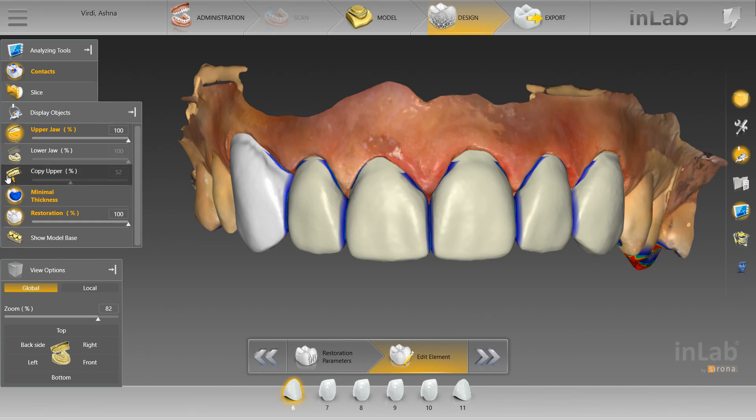So I'm going to overlay the copy scan, and after going through all the steps prior to getting to the design phase, you're going to mark around the wax up to determine what you want the software to copy. Once that's done and you're in the design phase, this is the initial proposal. The point of this video is to display what needs to be done after you get your initial proposal in order to have this look flawless.